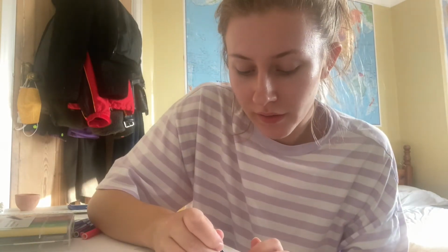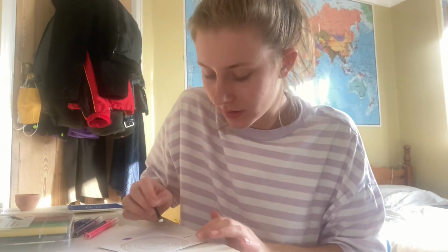Yeah, so what I'm doing is I've got that PVA from before just in here on the brush, which I also used before, and I'm just going to brush over the whole thing with a layer of PVA just to seal it, basically. The PVA has dried out a little bit, which is kind of annoying, but I'll just rub it over. So yeah, I'm just going to cover the whole thing, like literally the circles, the thread, the whole lot in PVA, and just seal it all in.